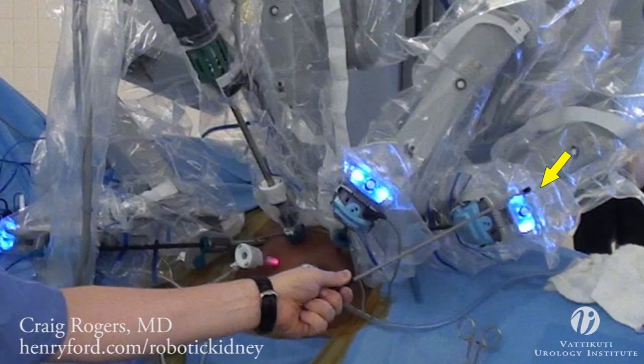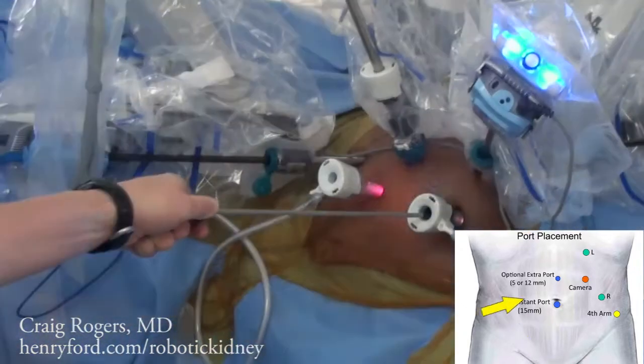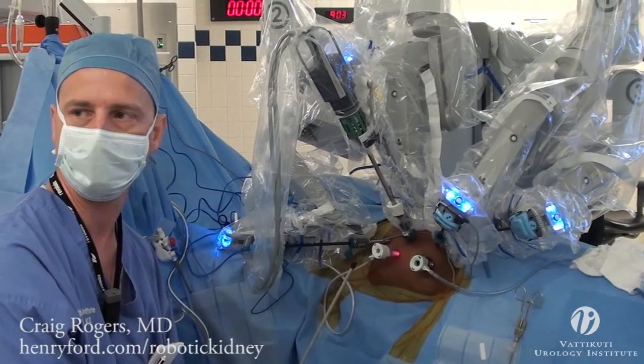A long bariatric trocar can help reduce collisions with the hip and other instruments. The assistant port is placed medially, usually in a peri-umbilical position. An optional assistant port may be placed cephalad to the primary assistant port for more complex cases. For right-sided cases, a 5-millimeter sub-xiphoid port can be placed for a locking grasper to provide liver retraction. For obese patients, the entire port template is shifted laterally towards the kidney.